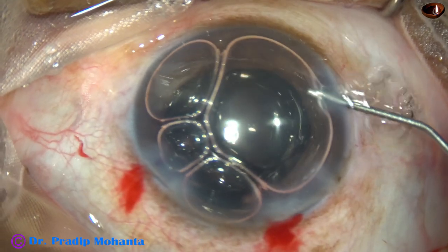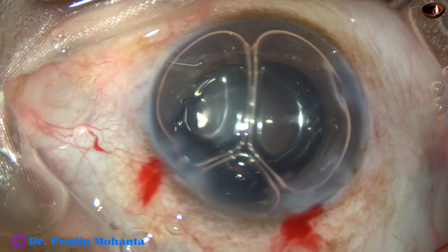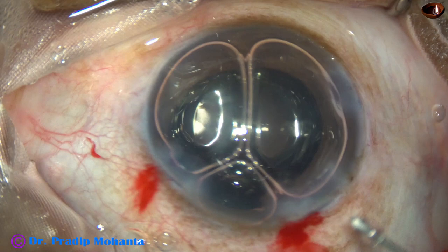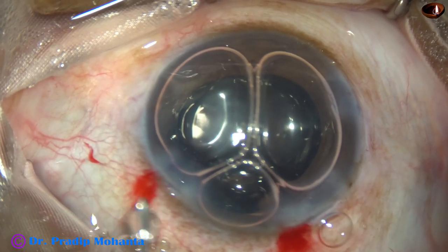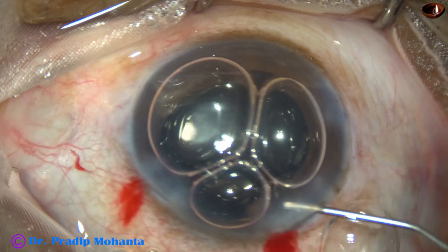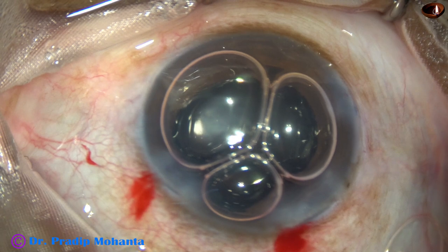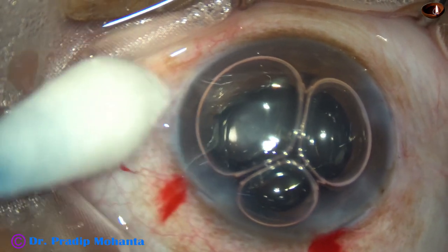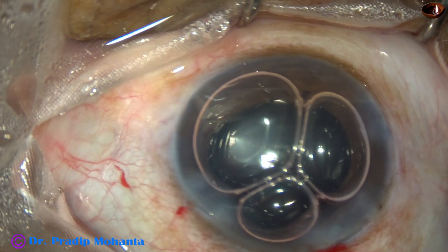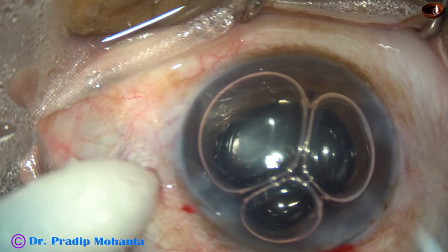Now I inject air again and inject pilocarpine to constrict the pupil. My plan is to constrict the pupil and to do a peripheral iridectomy by the vitrectomy cutter at 12 o'clock. But here I find some vitreous strands, so I take a Vannas scissor and cut these strands.